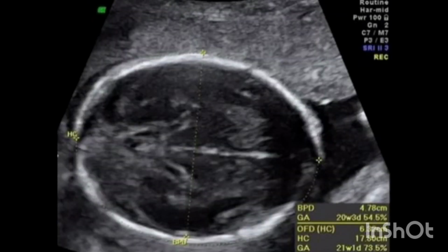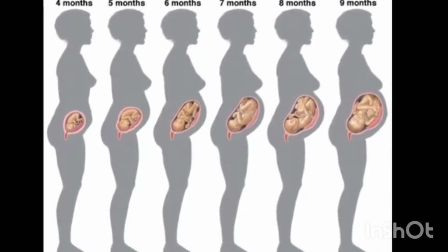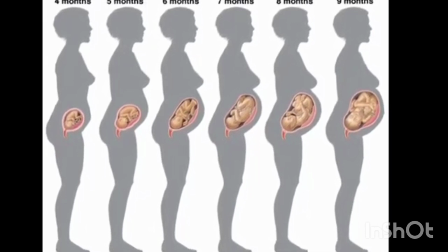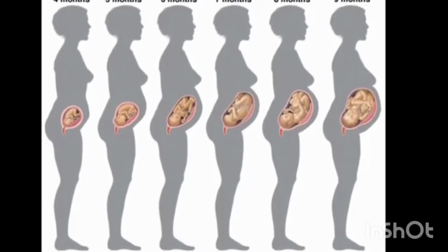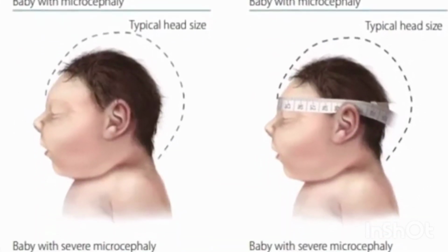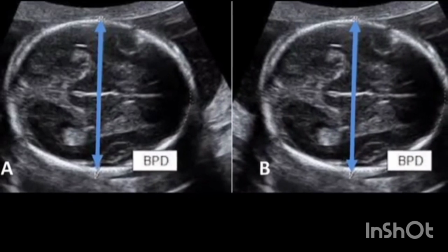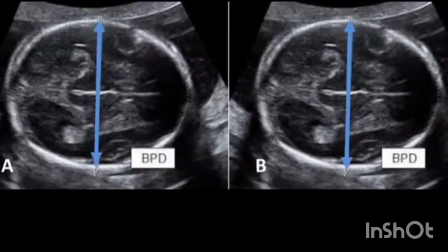Biparietal diameter in fetus has been reported to correlate well with gestational age. Biparietal diameter, aside from being used to estimate gestational age and fetal growth, is also helpful in the detection of fetal abnormalities. The biparietal diameter remains the standard against which other parameters of gestational age assessment are compared.